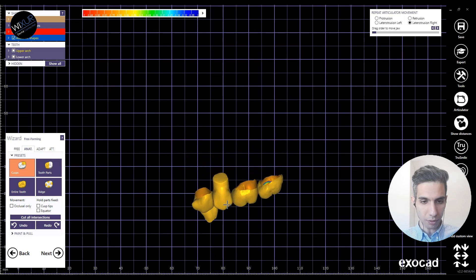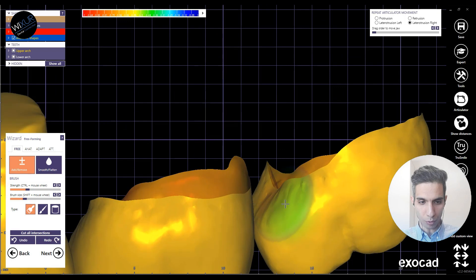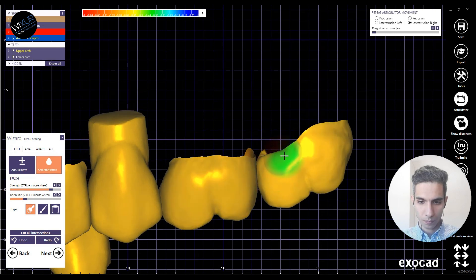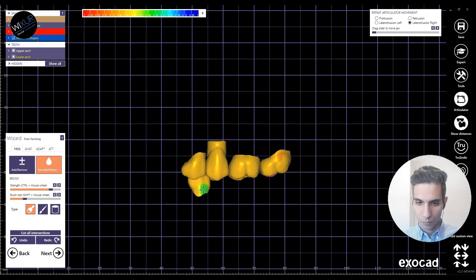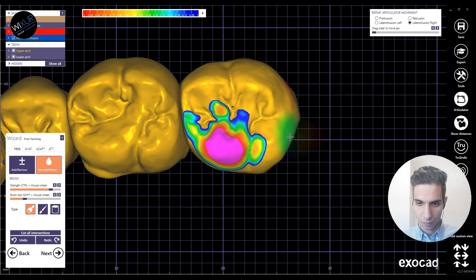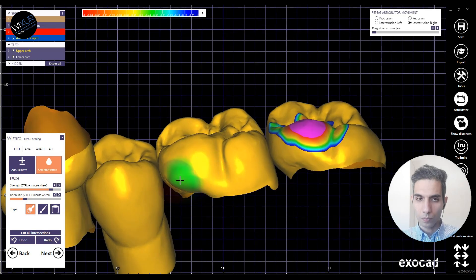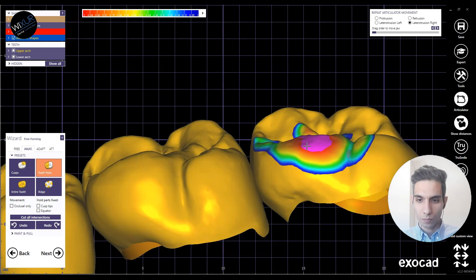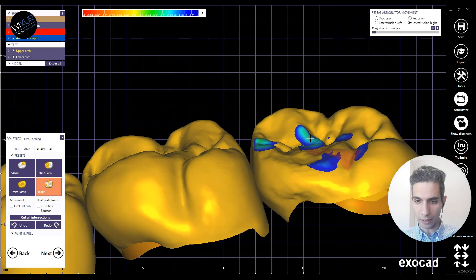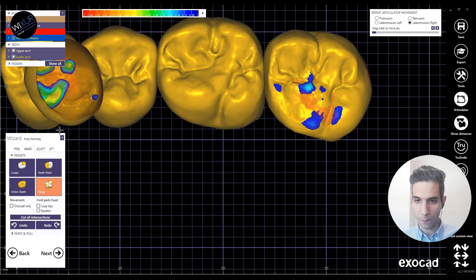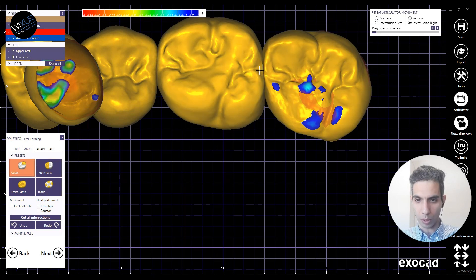Now we are in the free-forming step, doing some remove, smooth, and flatten operations. I want to lower this lingual cusp, but I think there is just too little space between the upper and lower jaw, so maybe I need to consult with the dentist.